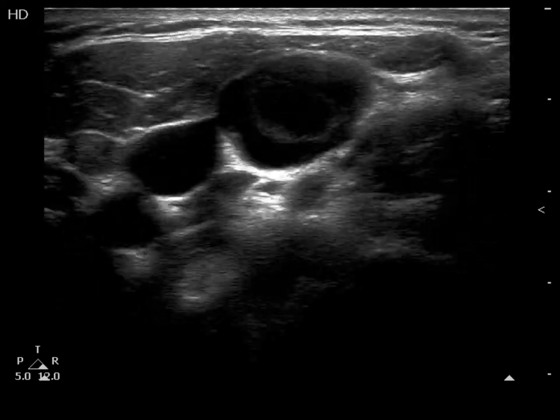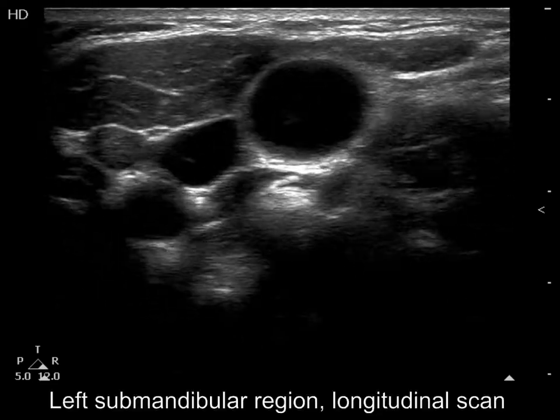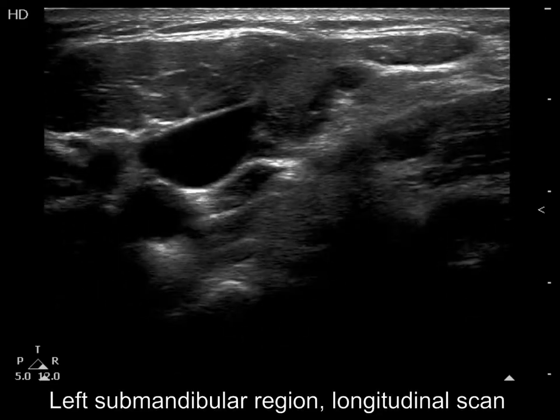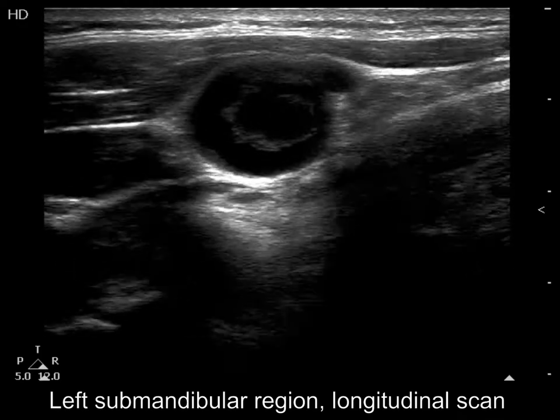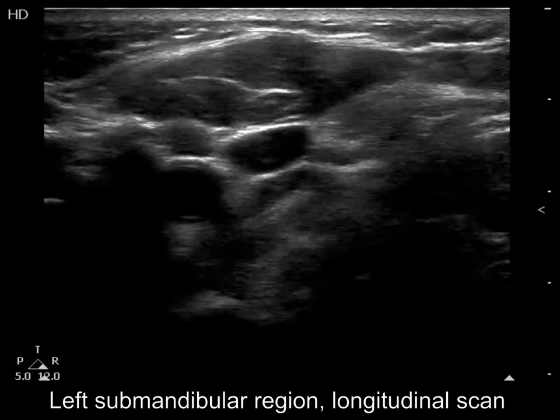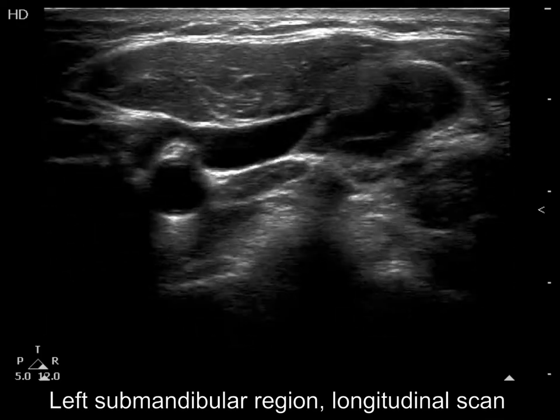There is a cystic mass in the left submandibular area. The presentation of this mass is very suspicious of a metastatic lymph node.